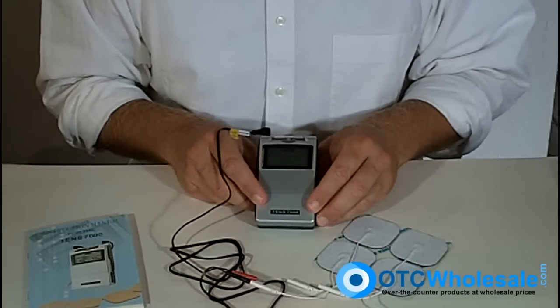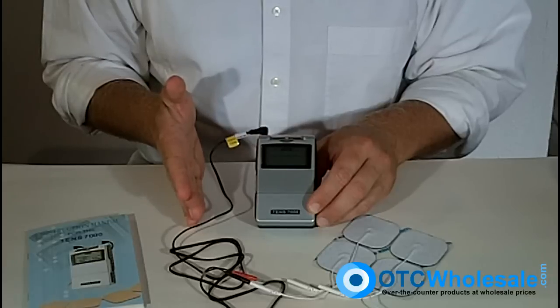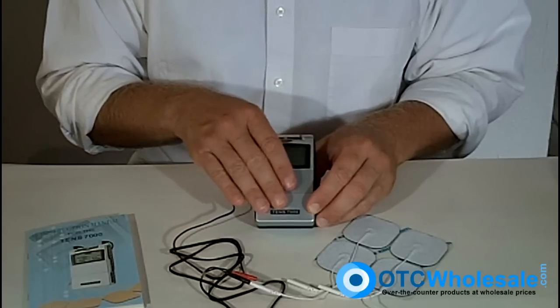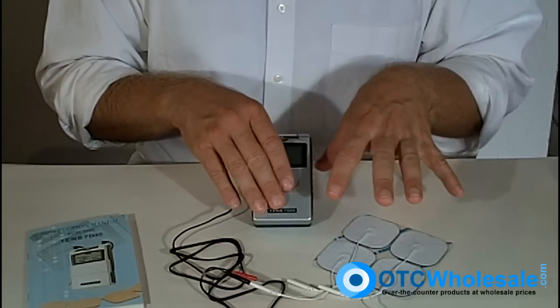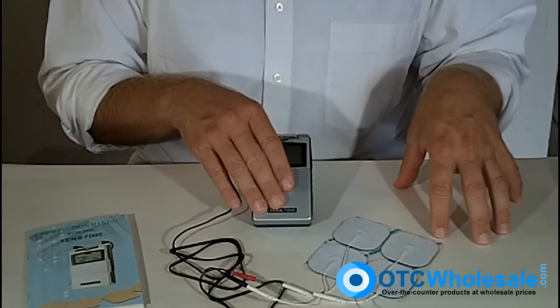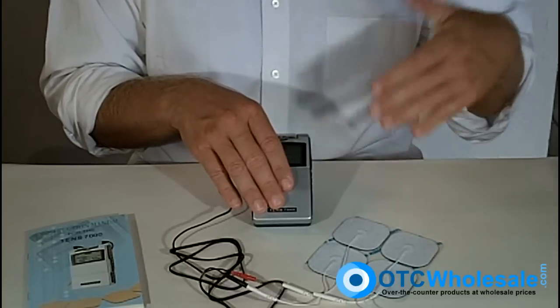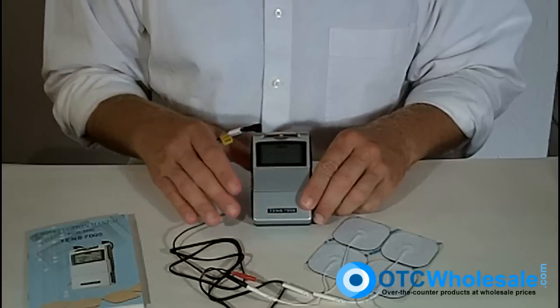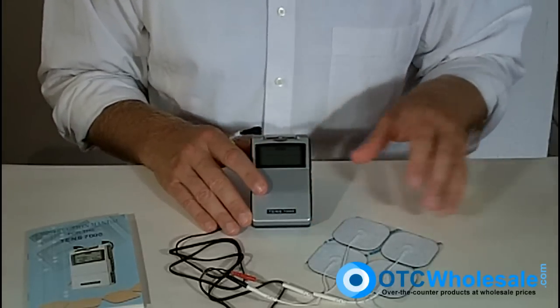That's the TENS 7000. This is part of a family of different units: there's a 3000 with three modes and the 7000 with five modes. Then there's a combination nerve stimulator and muscle stimulator, which is the twin-stem unit. On the other side, you've got the 7500, which is a three-mode muscle stimulator — not for pain mitigation, but for keeping muscles from atrophying or even building muscles with passive stimulation.